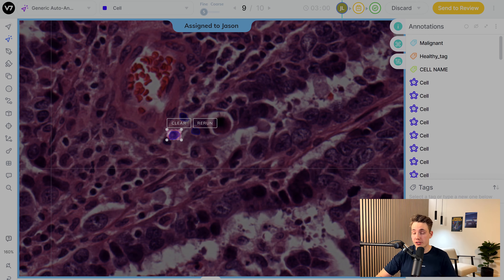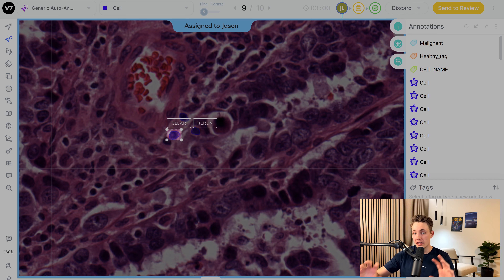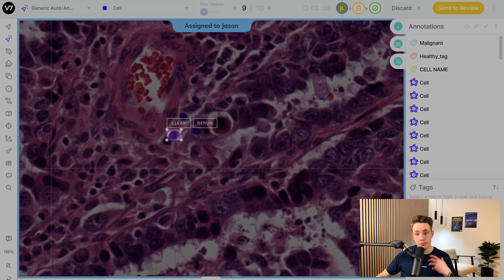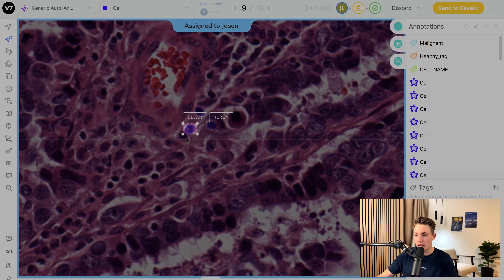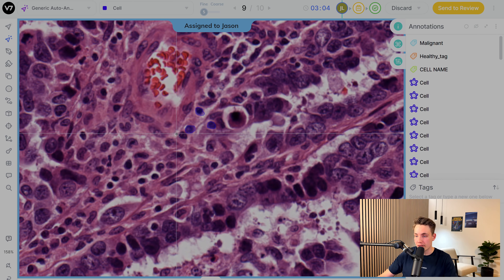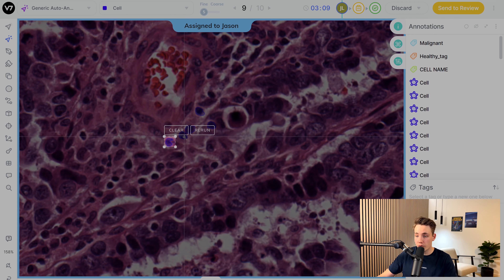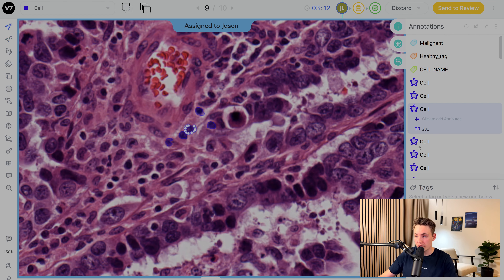This is a really awesome feature that can save you a lot of time. Just imagine labeling all these cells individually — instead, you train a model with an initial dataset, throw in these WSI files, and get fully annotated images. You can have different review stages to make sure your images are annotated correctly. I'll go through a couple more examples. We draw a bounding box around the cells we want to detect. We can also go in and assign attributes to individual cells by clicking 'add attribute' on the right.